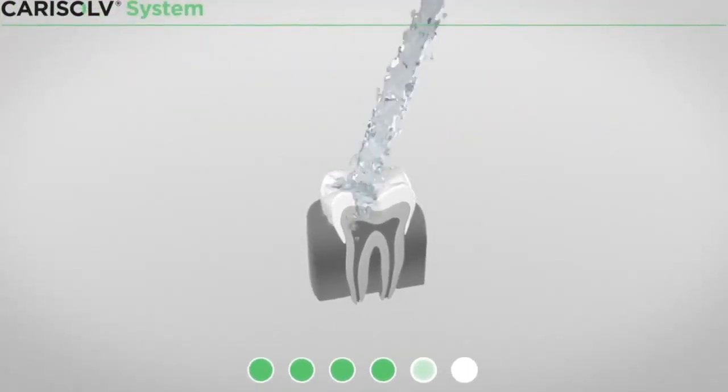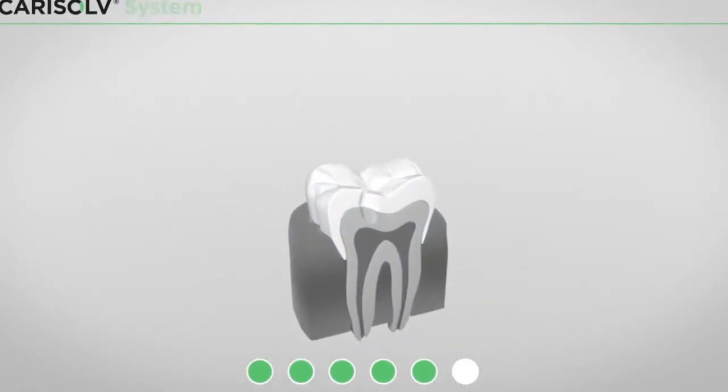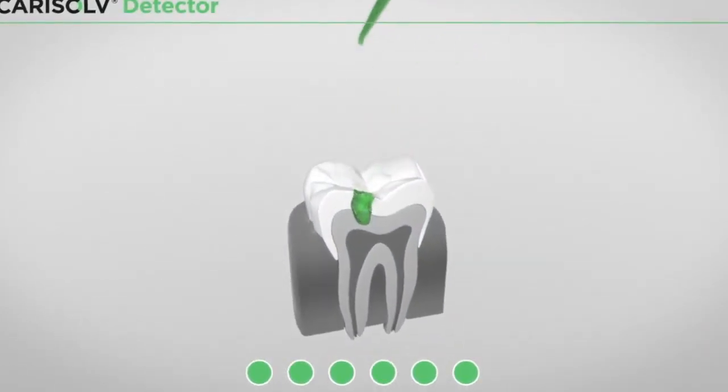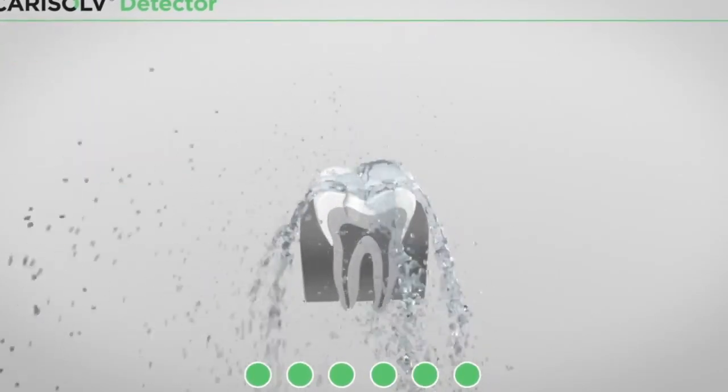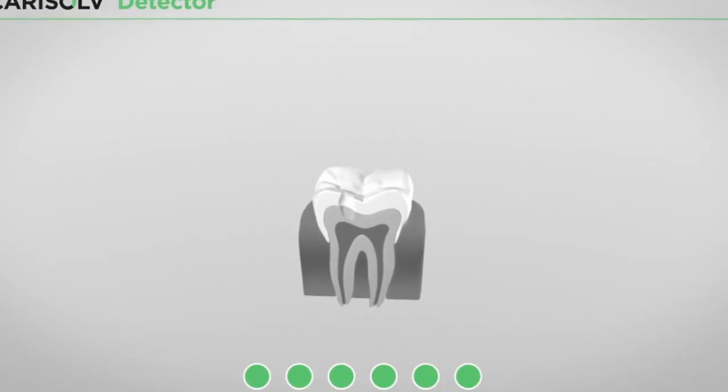The cavity is rinsed and blasted. The detector is applied after waiting for 30 seconds. The cavity is rinsed. Last, the detector indicates whether all caries are gone.